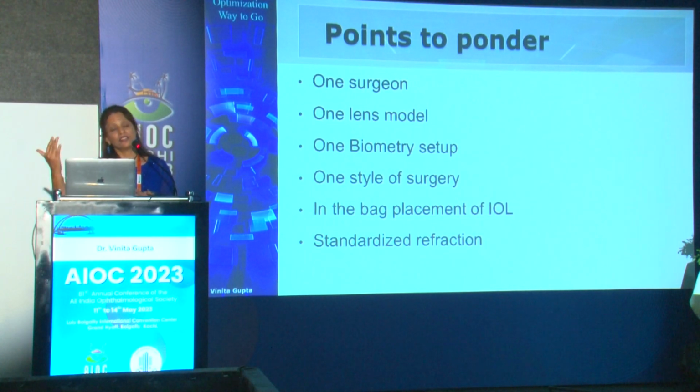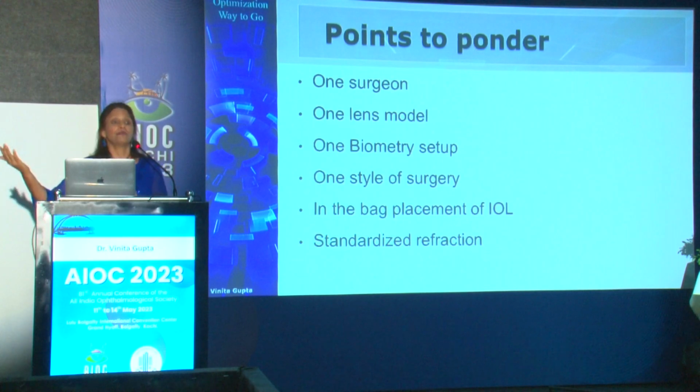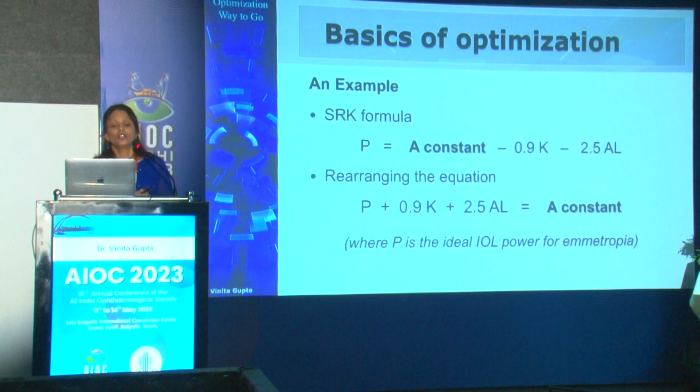And a standardized refraction, where the postoperative refraction is being done for every patient, that also has to be standardized. So let's take a basic example using the simplest SRK formula. We just rearrange this equation to get this A constant. This is how we calculate it, okay?